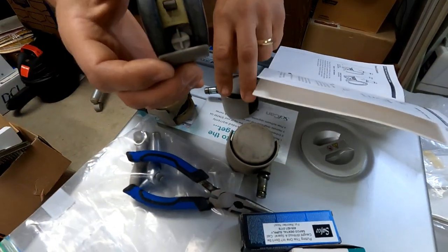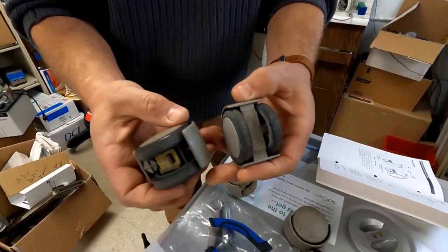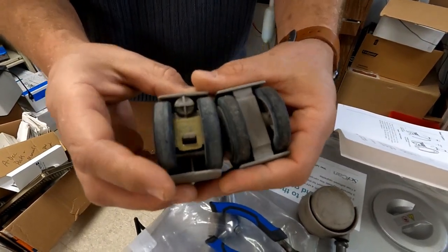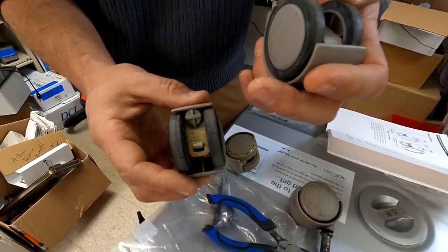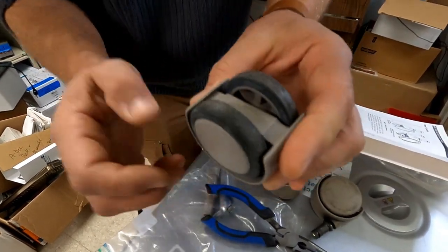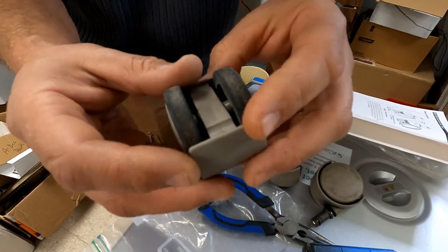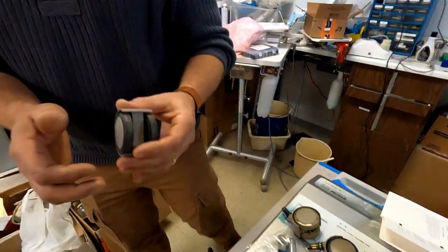Now, I did say that not all wheels are this way. And unfortunately, that's true. A set of wheels like this, you just have to replace them. And just so you can trust me, I just tried this, and I'll show you what it takes to actually get these apart over here.